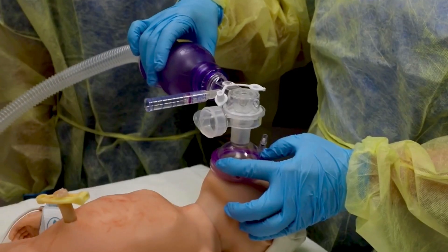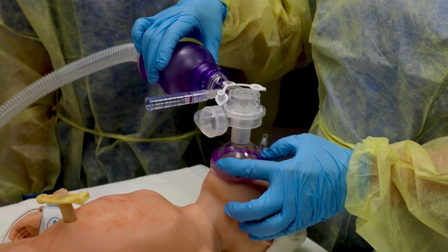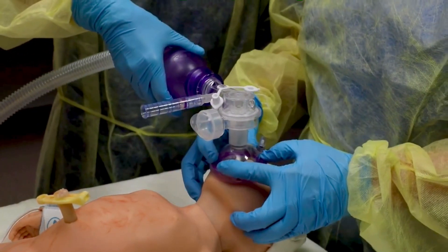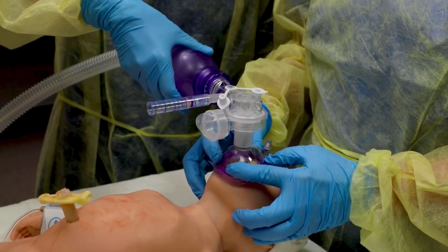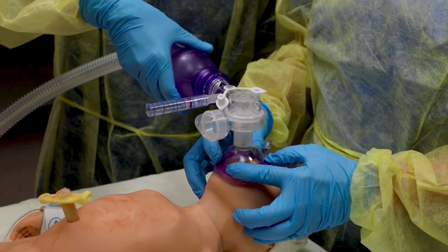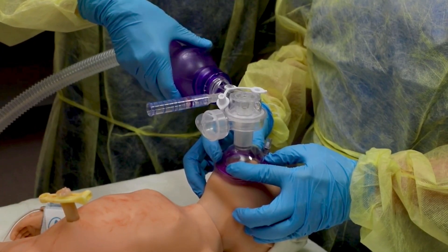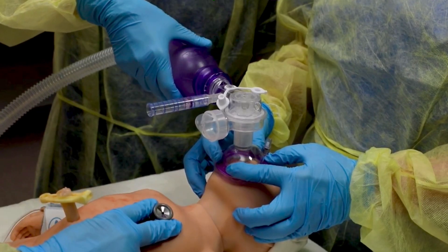If you cannot maintain a good seal, try the two-hand technique. Hold the mask against the face with your thumbs and first fingers. Place the other three fingers of each hand under the bony angle of the jaw and lift the jaw forward. Hold the head in sniffing position. An assistant gives the breath and a third person is needed to monitor heart rate and chest movement.